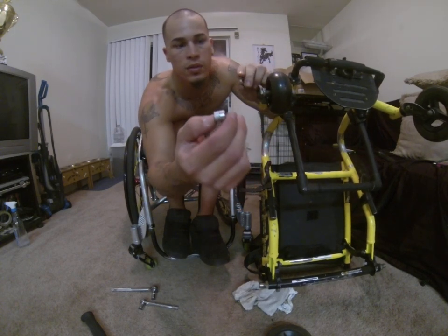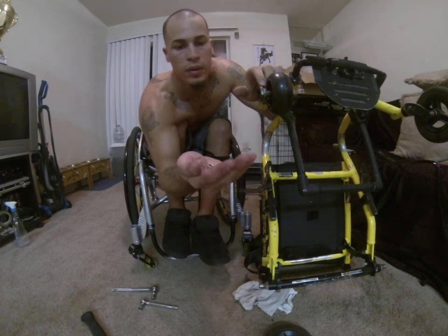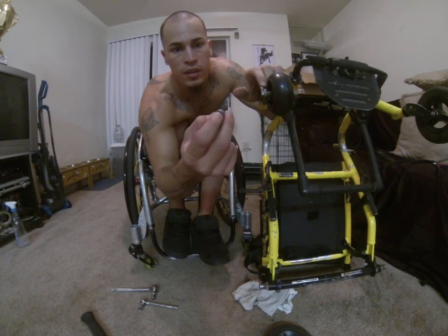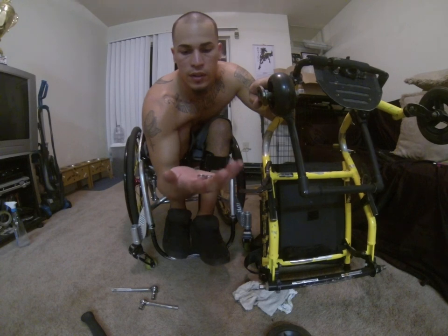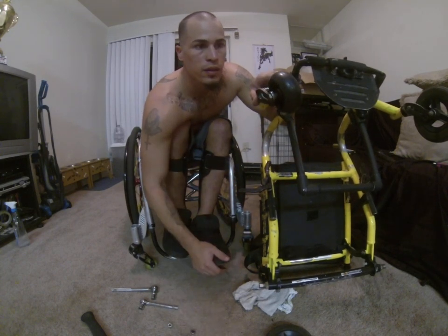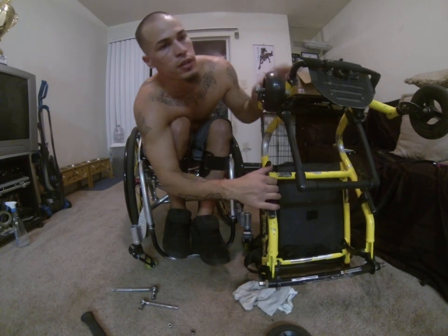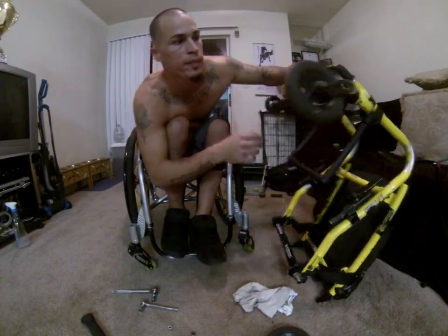Some of them are aluminum, some of them are chromed out, and they cost a little more. Some of them have a stronger base. These are really good. These are about $2 a piece. They're thinner and they're solid steel, so they'll last a long time. They won't rust out either. So, you know, I might change the bearings on here just to make it spin faster, but pretty much that's it. So I'm gonna repeat the same process for the other side.